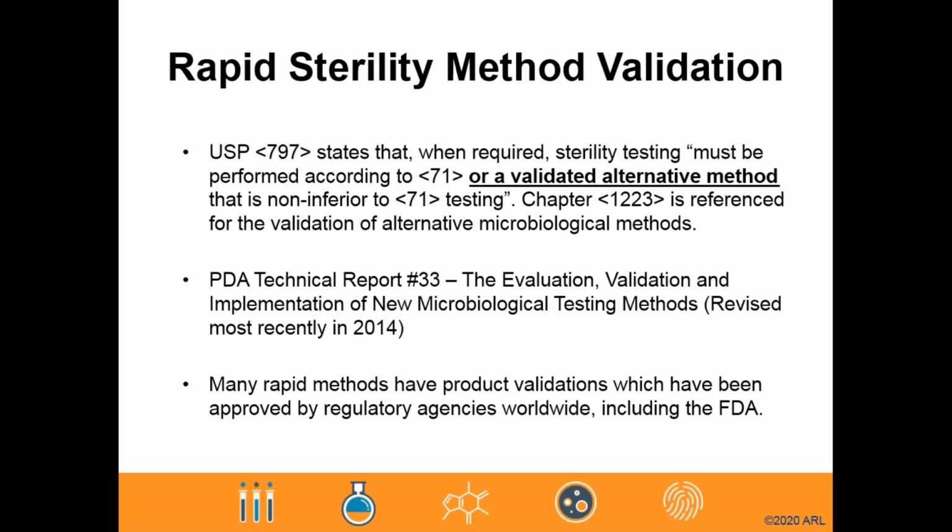Historically, the task of implementing rapid sterility testing was considered very difficult and a barrier to entry for QC microbiology labs not familiar with alternative rapid methods. However, regulatory agencies have responded and have published additional guidance and documentation to assist implementation.